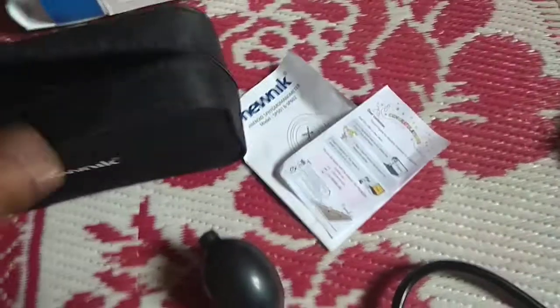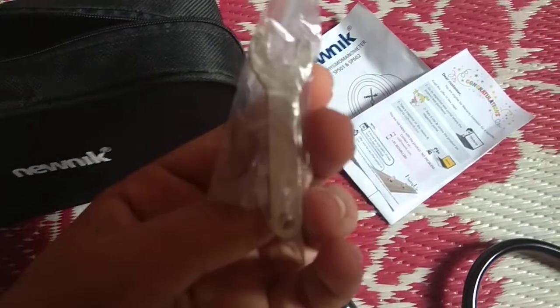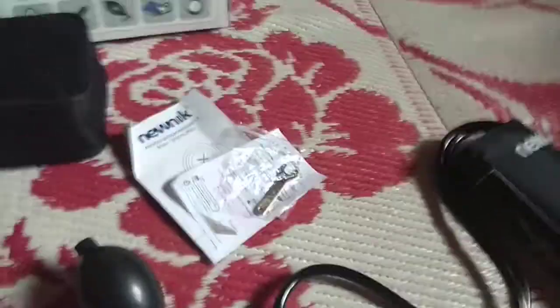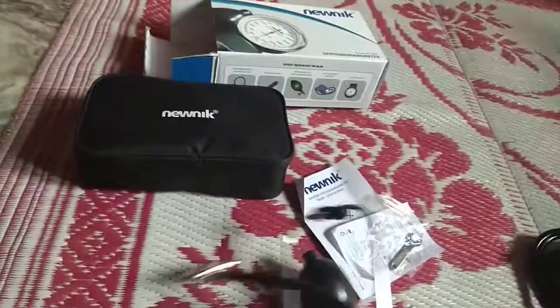Then you get this stuff in which you will get warranty for 6 months — you have to review a product and then you will get it. You also get this small spanner type. And since I have used it, you will even get a stethoscope, which is basic, but according to me this stethoscope is really good.